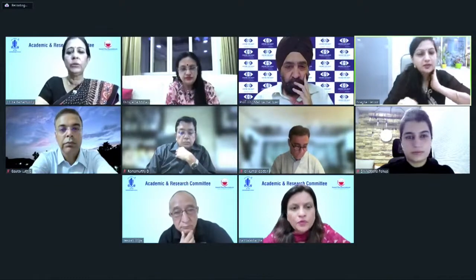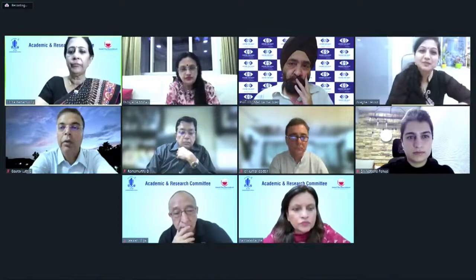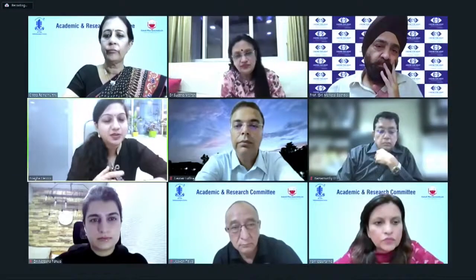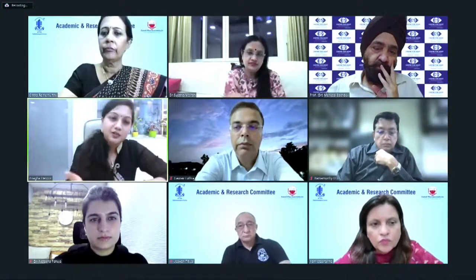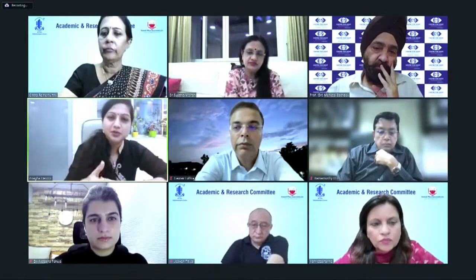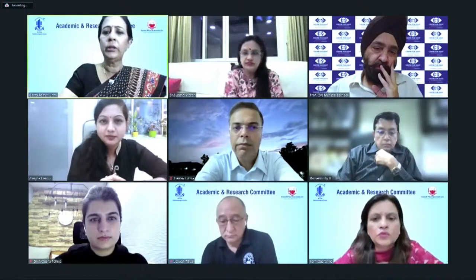Can I just ask a question, ma'am? Yes, Naga. Lovely videos, Dr. Sujatha ma'am. I just wanted to ask, what's the usual consensus? Flap striae are known to be more common in thinner flaps. So suppose you have a 90 micron flap, and on the table you see that the moment you remove the speculum, there is a slight flap misalignment, and you put it back. Definitely, if there is a problem, then you put in a BCL. But do you put a BCL in all the cases where you have a 90 micron flap? No, I wouldn't.